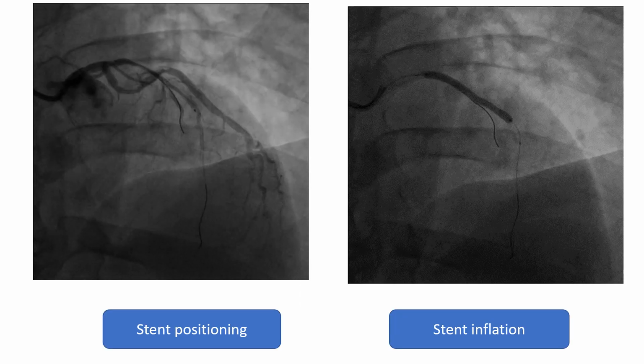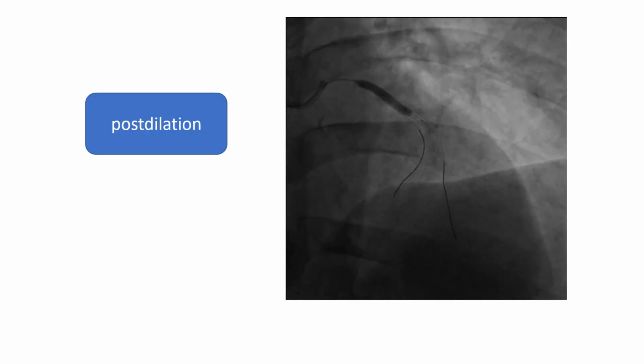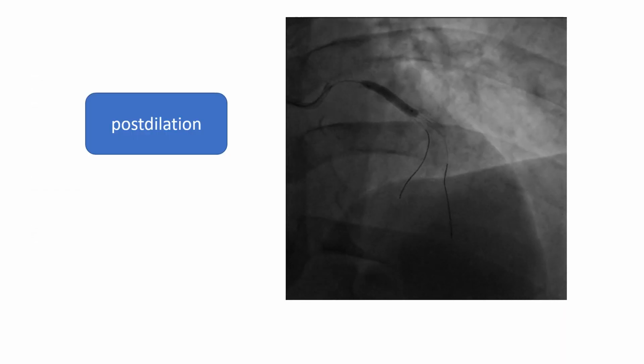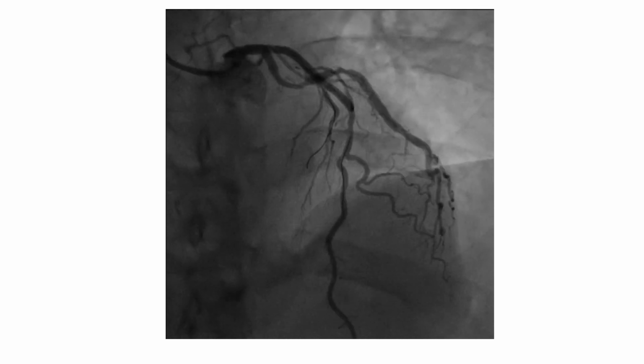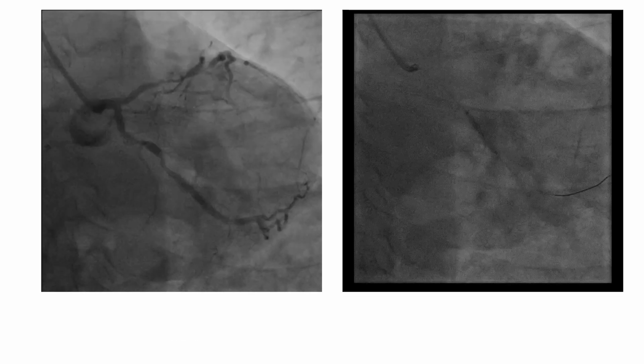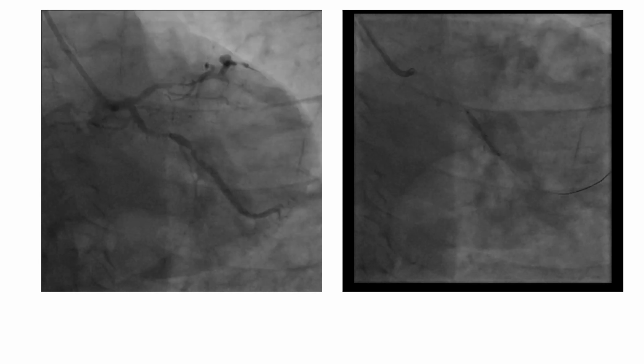Here, stent positioning and stent inflation, post-dilatation, and a good final result for the LAD. Then we turned to the left circumflex. Pre-dilatation was easy.